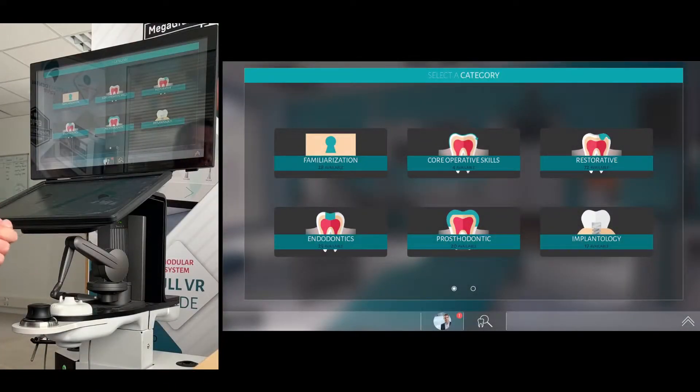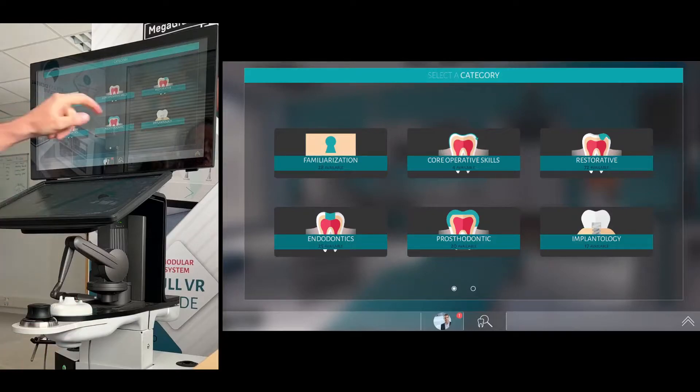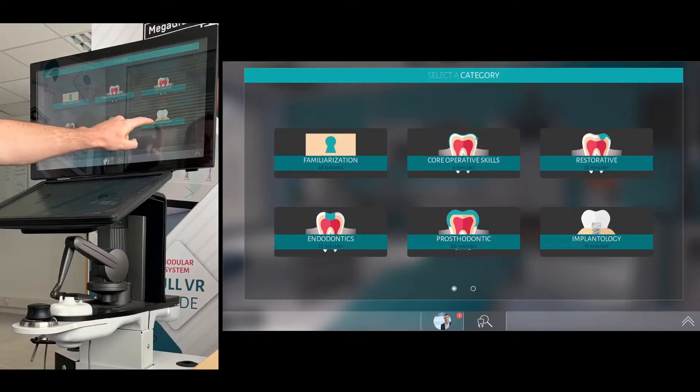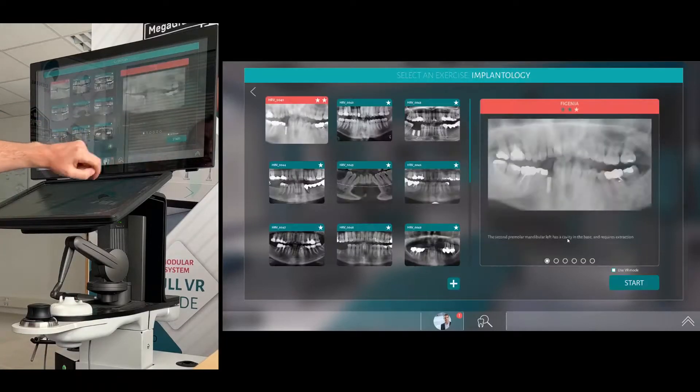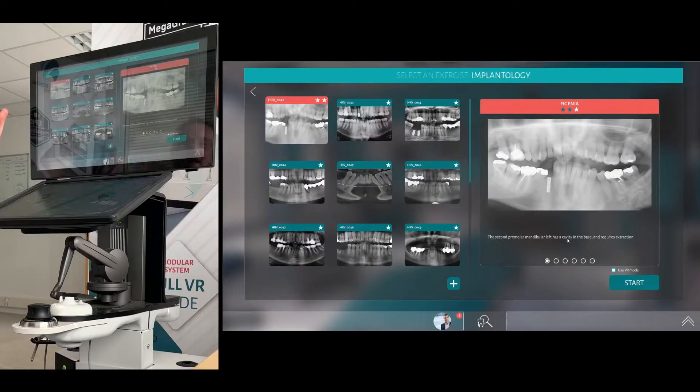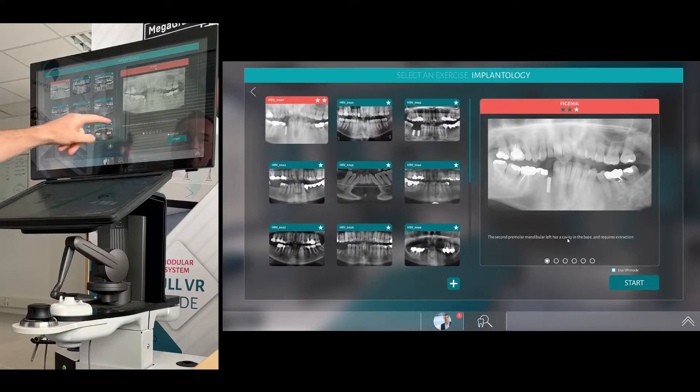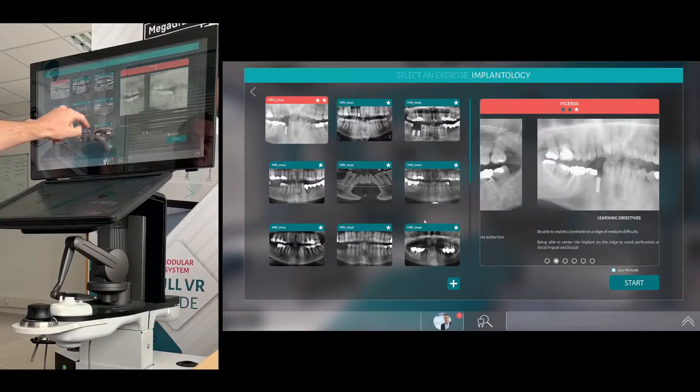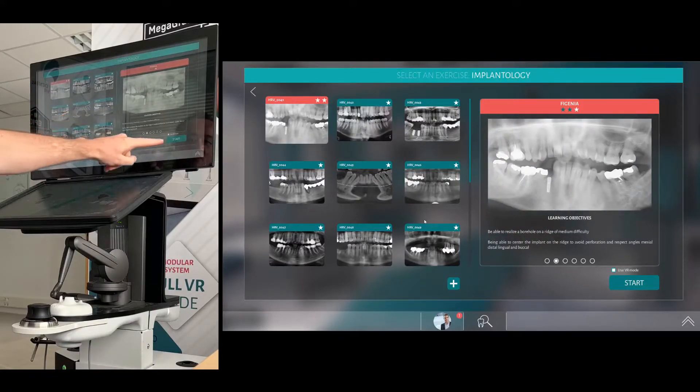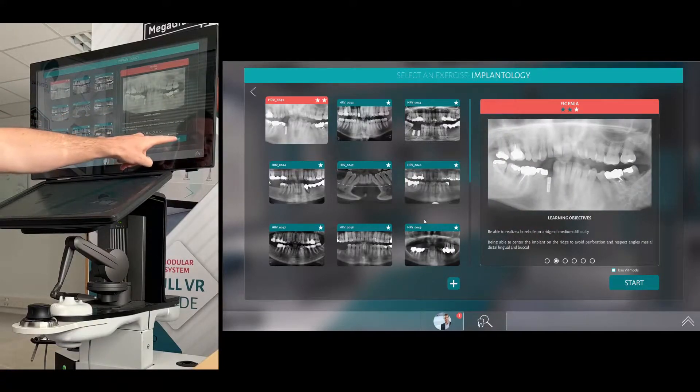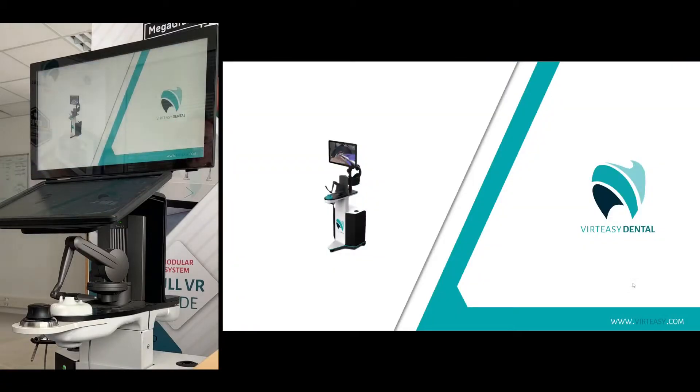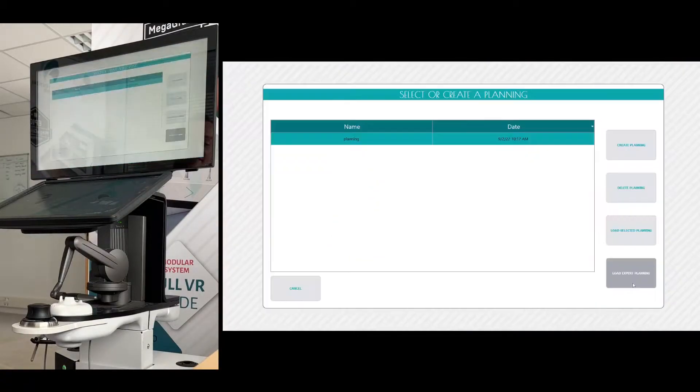Hi, James here and just wanted to show you how to use implantology and do the planning on here as well. So I'm going to use the first exercise 0041 with the Figenia patient. Click start in the bottom right.